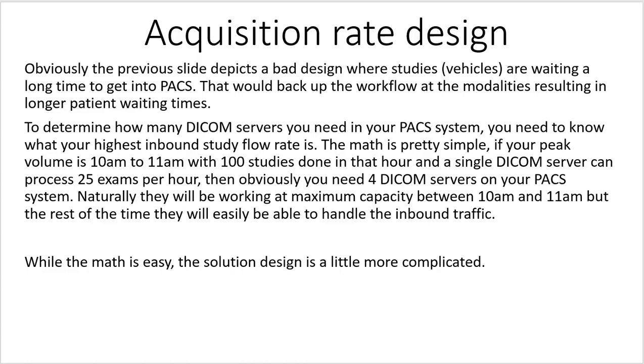So, 100 studies in 1 hour, a single DICOM server, 25. 100 divided by 25 is how I came up with 4. Now, while the math is easy, the solution design is a little more complicated.